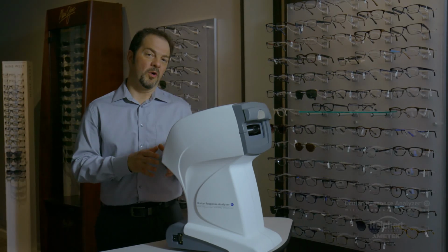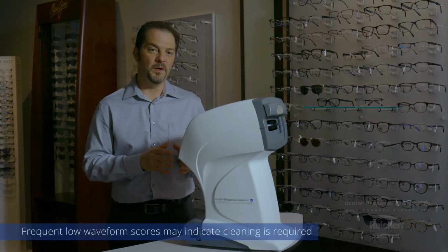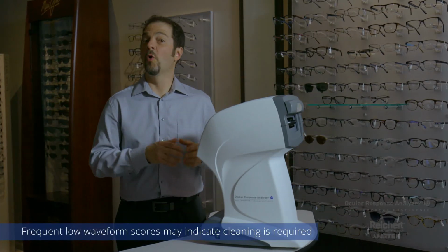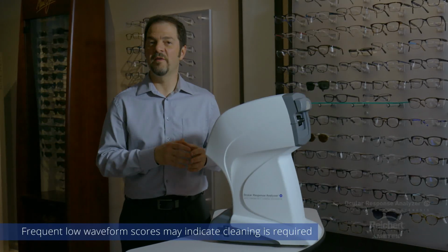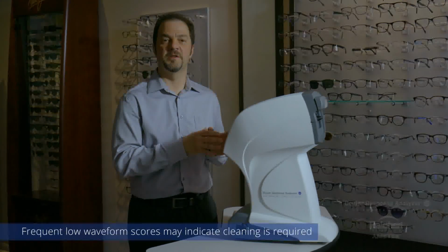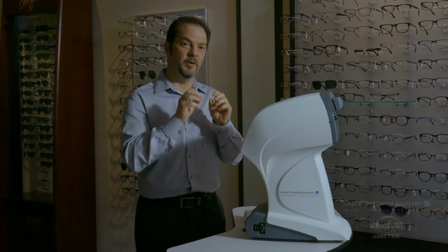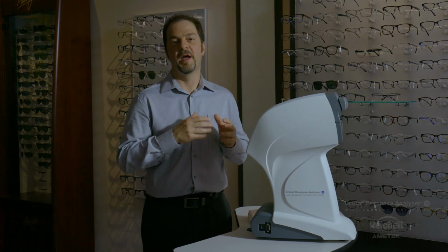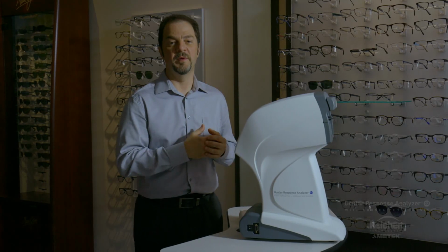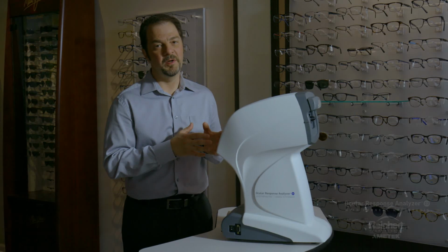The waveform score is actually a good indicator of whether or not you need cleaning. If all of a sudden one day you notice that your waveform scores are lower on average than they usually are, or if you're having trouble obtaining good waveform scores on patients, it could be because the optical surfaces on the instrument are becoming opaque. Every time you measure a patient, some tear film will spray on some of these surfaces, and over time and lots of patients, those surfaces begin to get dirty and need to be cleaned off. So your waveform scores start to go down, probably a good time to clean the instrument.